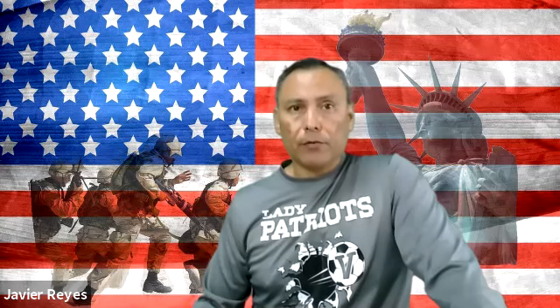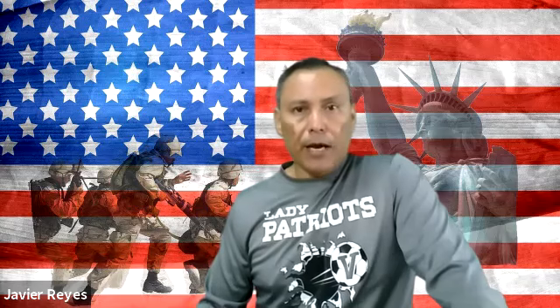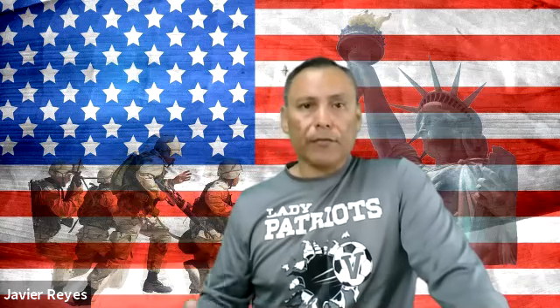The second most common reason is quantity not sufficient. What does that mean? Quantity not sufficient. That we did not collect enough. Exactly, right? Underfilled tubes. Maybe you lost the blood flow, you couldn't get it back, and you thought, well, maybe I have enough. Maybe you don't. So you should always collect the specimens until the vacuum is exhausted, okay? Those are the two most common reasons why specimens are rejected.